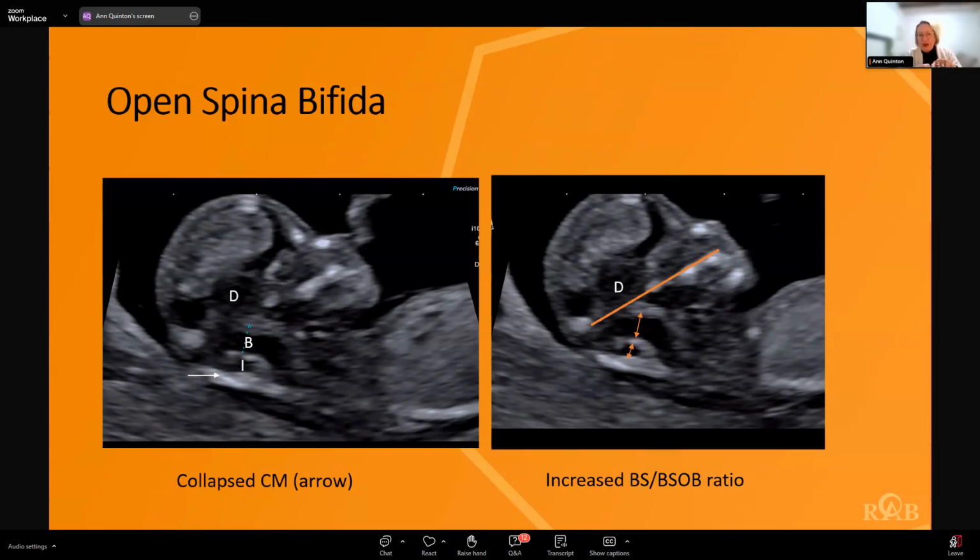It depends. If you really can't see it well, we'd offer the person a transvaginal scan. If that's not an option or they decline, if we're bringing them back for an early anatomy scan, they're brought back at around 15 to 16 weeks. If we had a really high suspicion that the brain was abnormal, we would probably bring that person back about a week later.